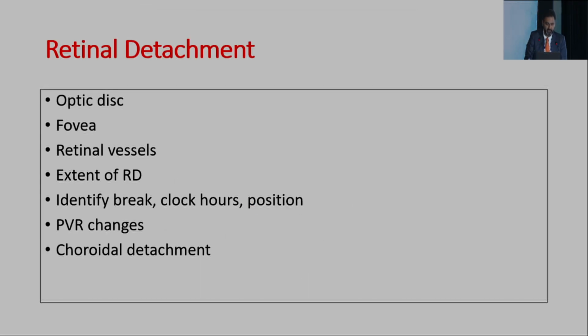This is just indirect ophthalmoscopy, and as I said, I'm going to skip that. I'm just going to look at how to represent what you saw, how do you adequately and accurately represent it, so that even if there is someone who did not see the patient, if they were just to go through the chart, or if you were to try and explain to them, they would have the same picture as to what you saw. So retinal detachment, we're going to just start off from there and look at different things because it's going to cover different aspects of the retinal drawing.